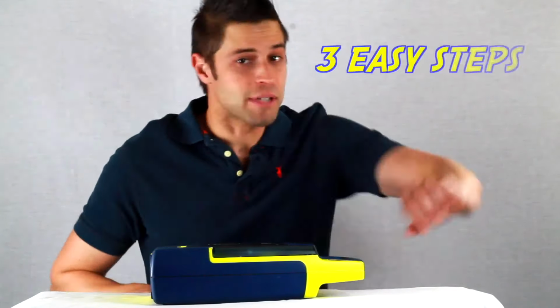Number 2, put the pads on. Number 3, follow the prompts. That's right, from then on, it'll tell you what to do. If the person needs a shock, it'll light up. You'll press the button, shock the person. If it doesn't, it'll tell you no shock advised, and you'll continue CPR.